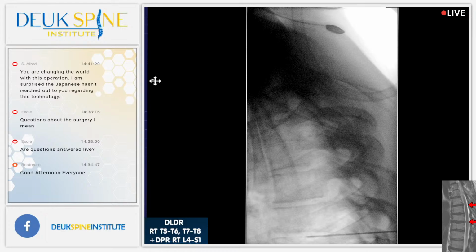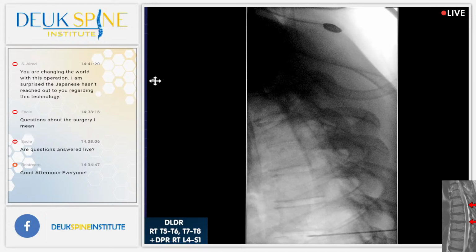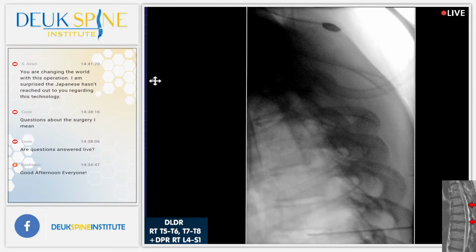The reason why, and this is the most challenging part of the surgery, is this. I think it looks better, right? So what we're doing, folks, is we have to have reliable navigational information. Since we're using this X-ray machine to navigate to the area we need to be in, we must make sure it's reliable. So we need to line everything up so that all the angles are proper. That's what we've spent our time doing, lining up the X-ray so that we have reliable navigational data from the spine itself and through the machine. It's very important.